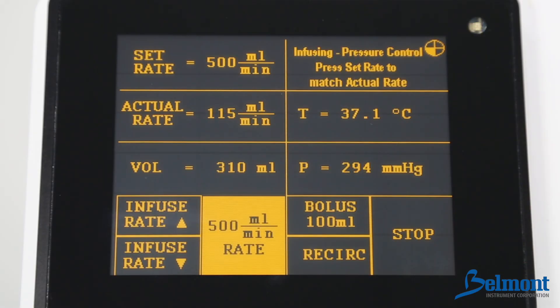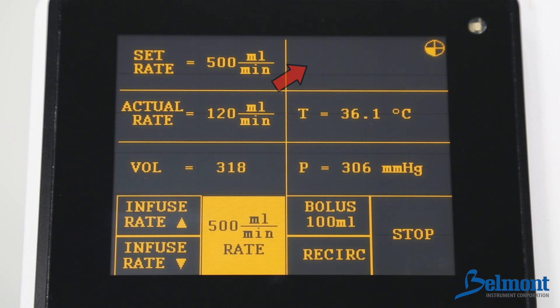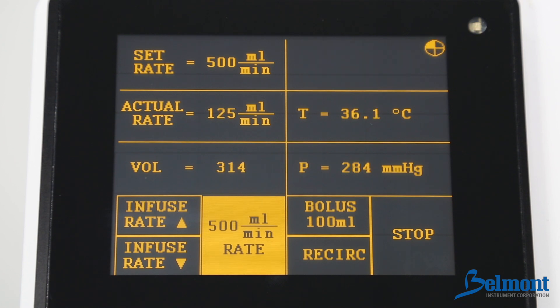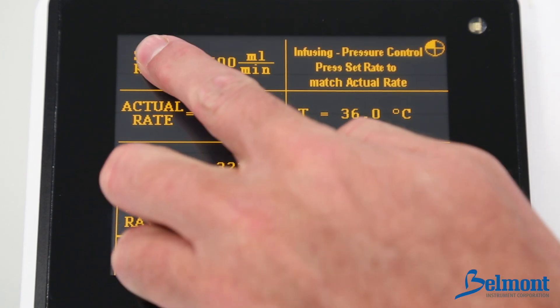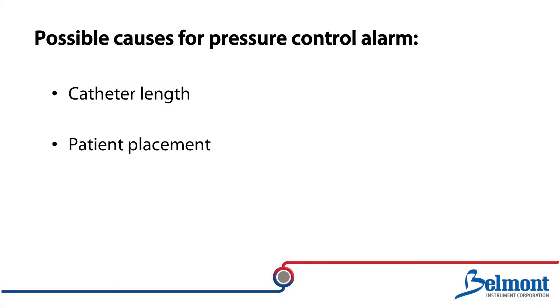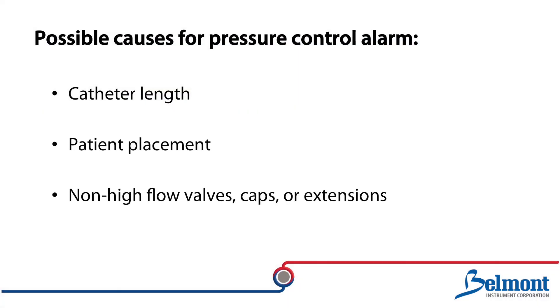Pressure control will display when the set rate is higher than the maximum allowable infusion rate. Infusion will continue during the pressure control alert, but will be automatically regulated within safe limits. To silence the alarm, press the set rate to match the actual rate. Catheter length, patient placement, and non-high flow valves, caps, or extensions may all reduce the maximum achievable infusion rate.